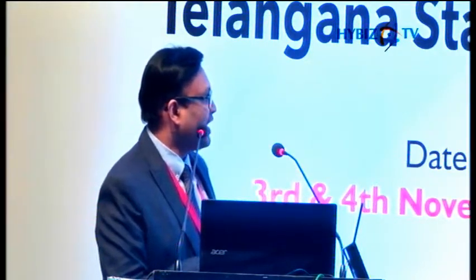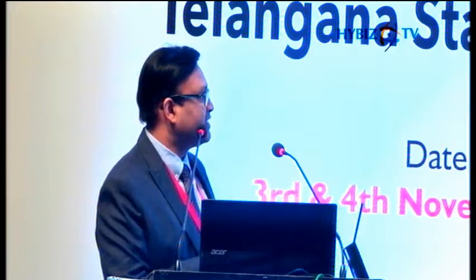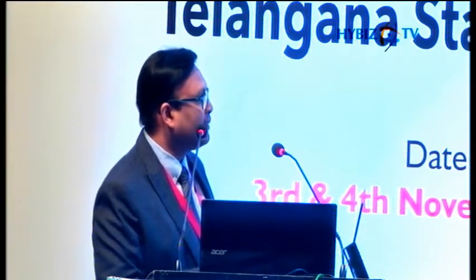So the recommendation is to use the 2D image only to measure the IVS thickness, LV cavity and the posterior wall. And the correct way of measurement is to take it perpendicular to the LV, just beyond the mitral leaflets, measuring the IVS thickness, LV cavity and the posterior wall. This is the way it should be done. It should not be an M mode cut.